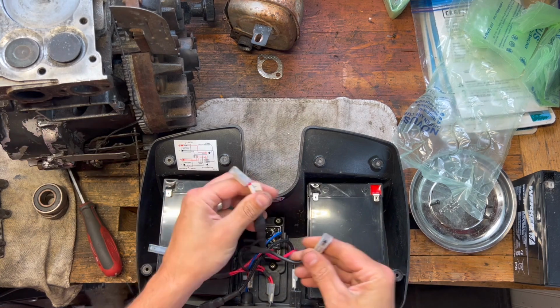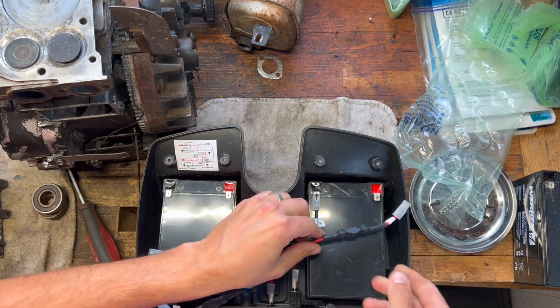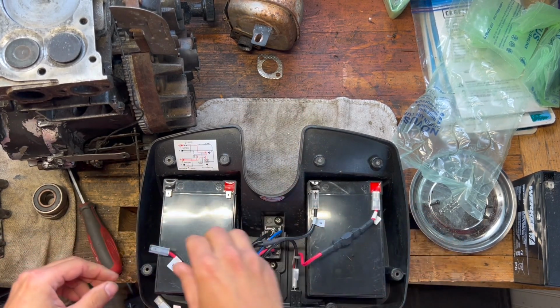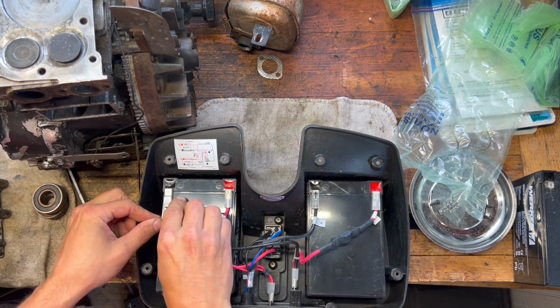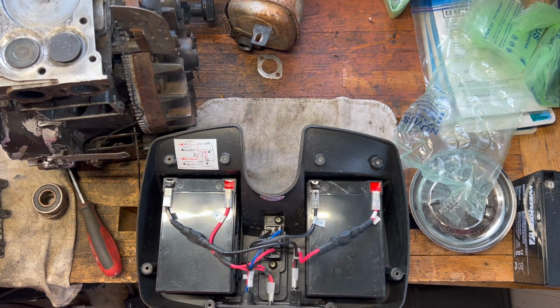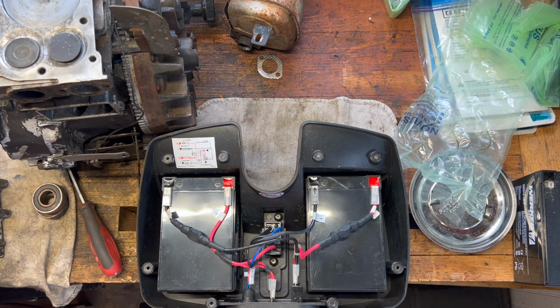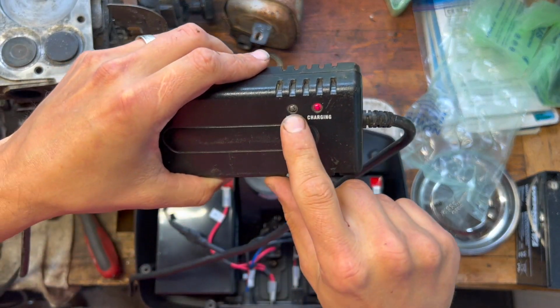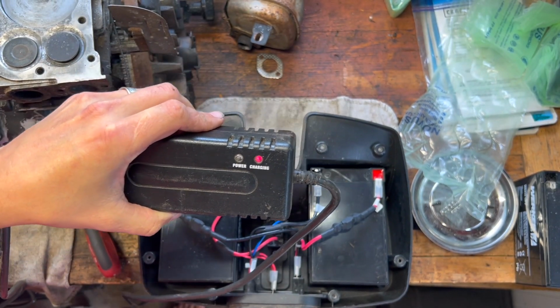Alright. Should be fairly straightforward. We got our positive and negative. Positive and negative. Let's plug it in and see if our light changes. Yeah, it did. Before it said power, now it says charging. Okay. So that's great.